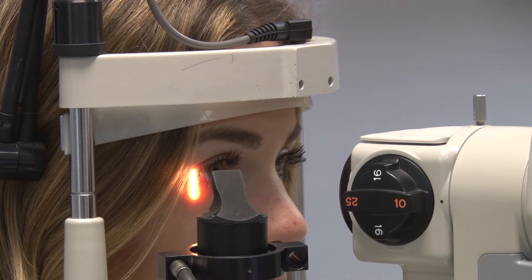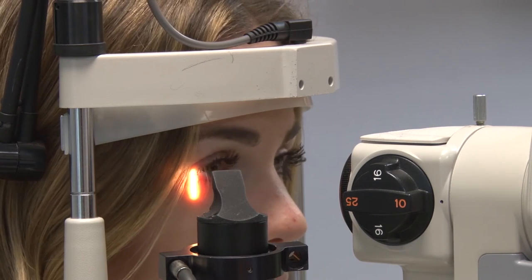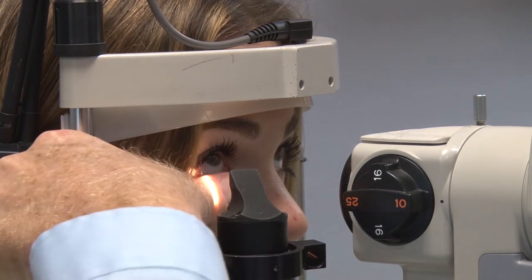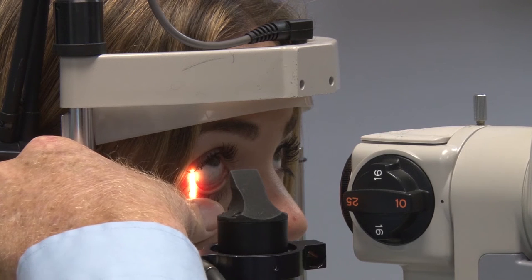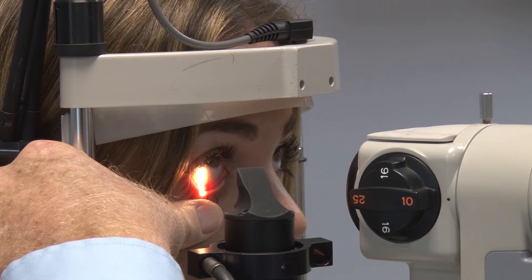The next step is to look at the lower palpebral and lower bulbar conjunctiva. The patient needs to look up, and the key to pulling the lower lid down is getting on top of the lashes and pulling straight down using this part of your thumb. Reach around the light source, have her look up, and pull the lid straight down. You can see both the lower palpebral and lower bulbar conjunctiva. As I sweep across, for the lower palpebral I'm looking at how smooth it is, how much injection is there, and whether there's any conjunctival cyst. When I get to the midpoint I move the light source over. In the bulbar I might see things like nevus and conjunctival cysts all the way to the inner canthus.